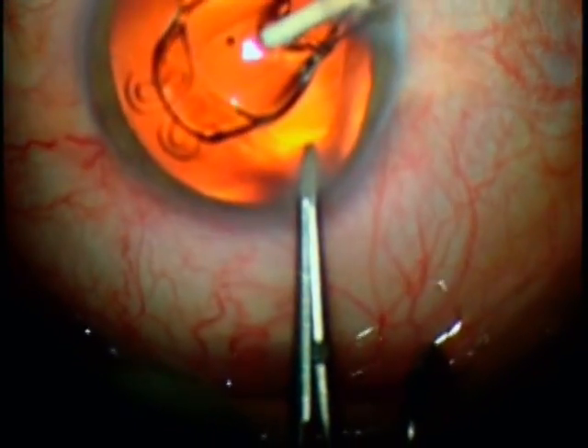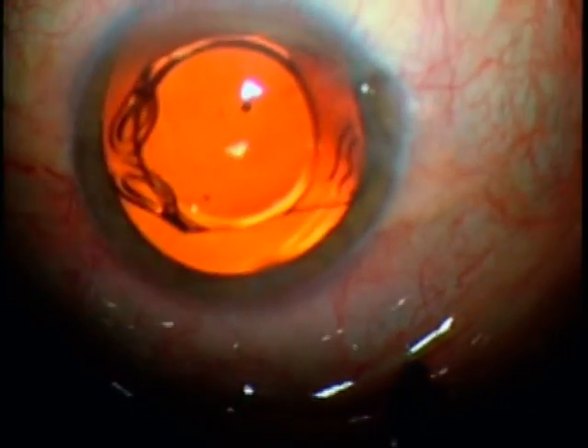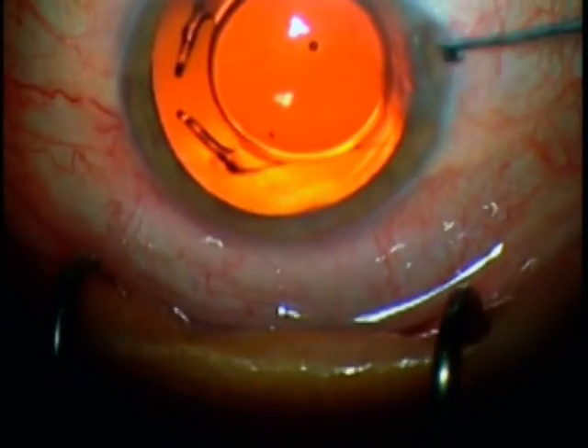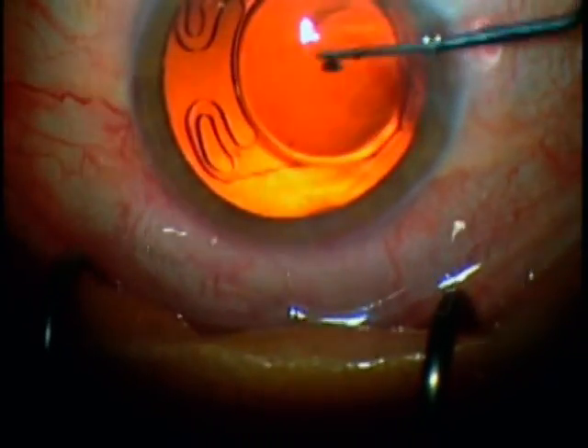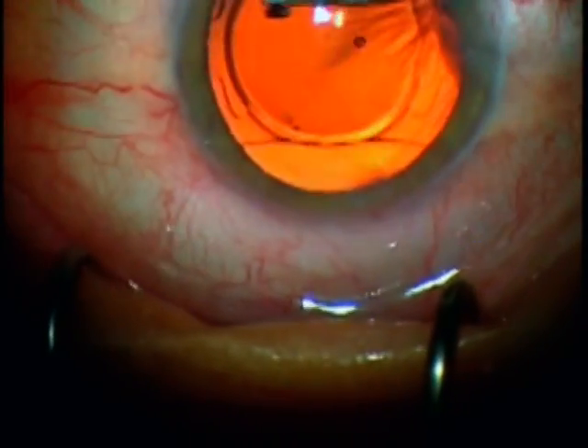A second instrument is used to gently and easily place the haptics into the capsular bag. A little bit of posterior pressure is used to pull the lens centrally and tuck in the distal haptics, and then the same procedure is performed in reverse to tuck in the proximal haptics.